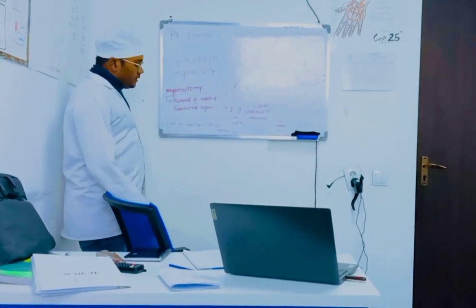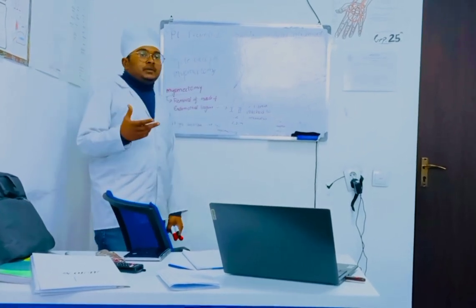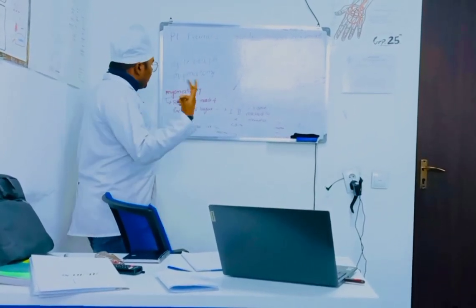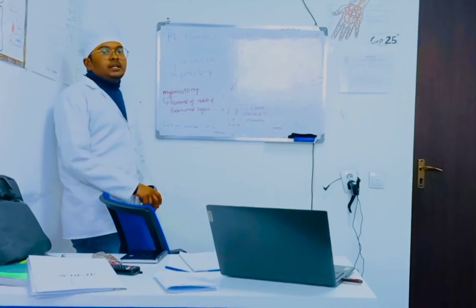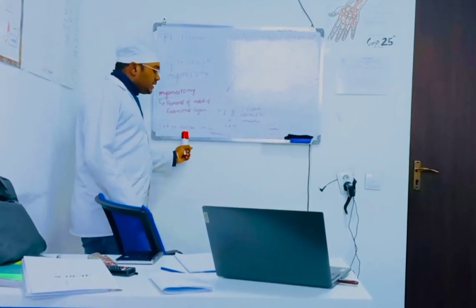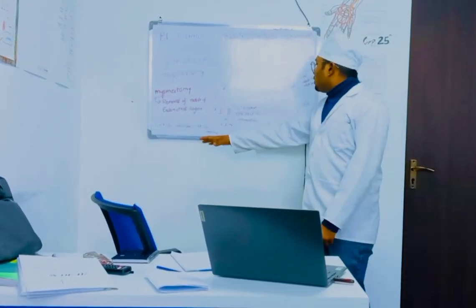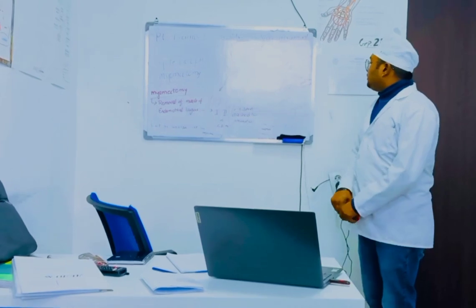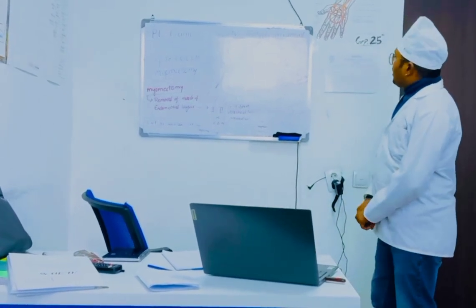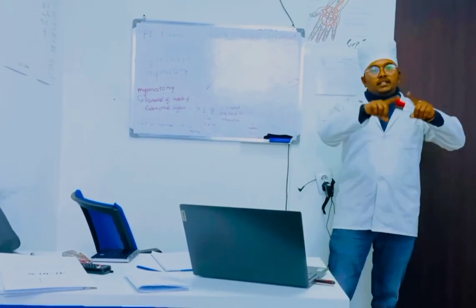And generally, if not hysteroscopic myomectomy, we can also perform laparoscopic myomectomy, when the fibroids involve types 5 and 6, the sub-serous layers. Then we have to go for laparoscopic myomectomy. And first we used 2 liters of fluid to dilate the uterus.